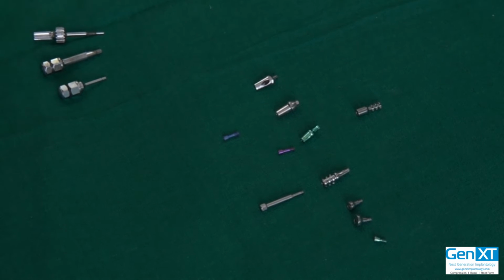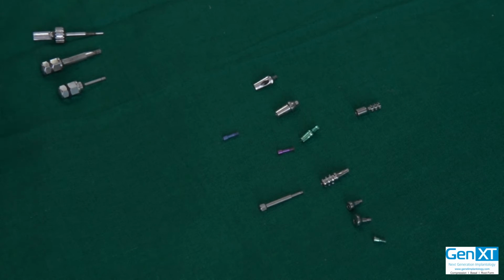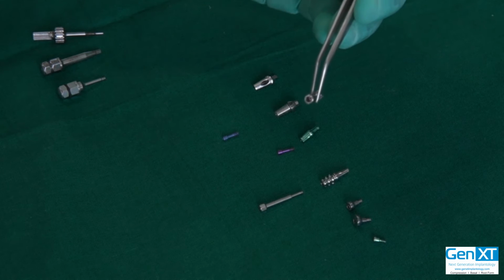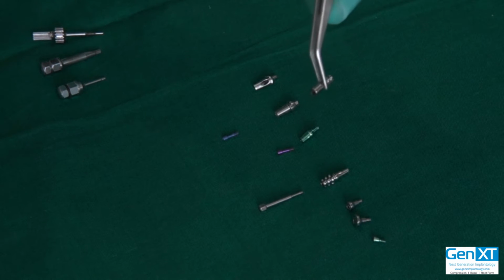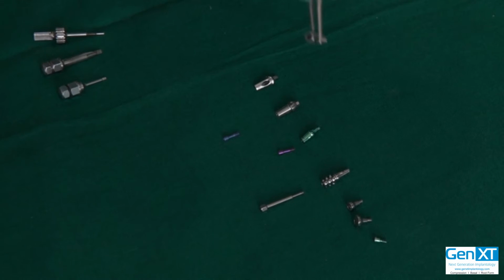I don't have an implant unfortunately, but what we will use in its place will be the analog. So this is the implant analog. It's metal, it's reusable, and it is an exact replica internally of the implant.